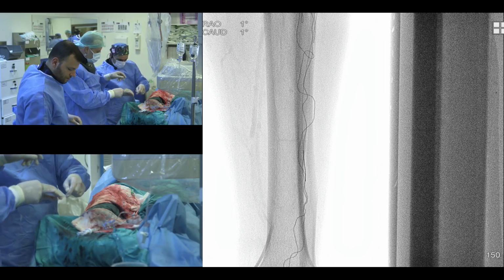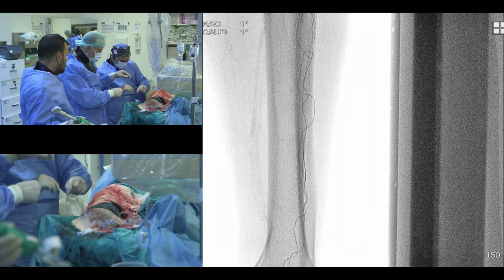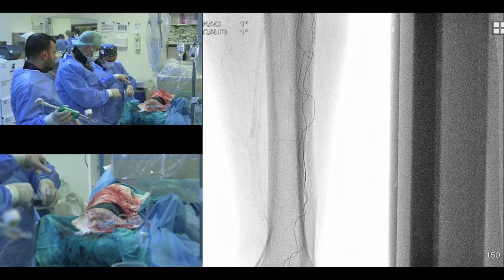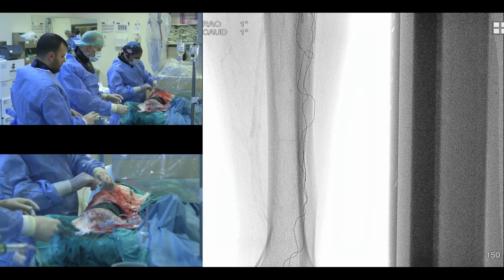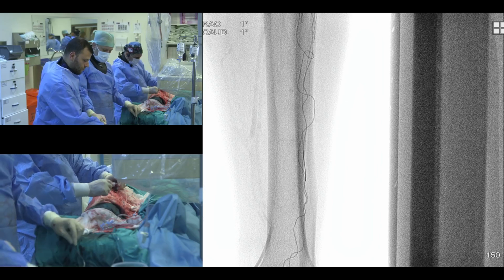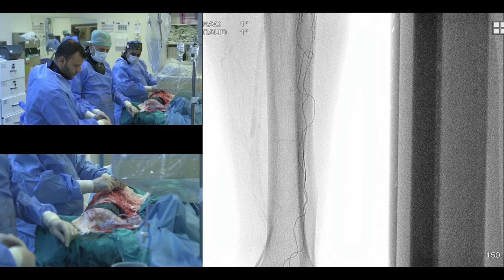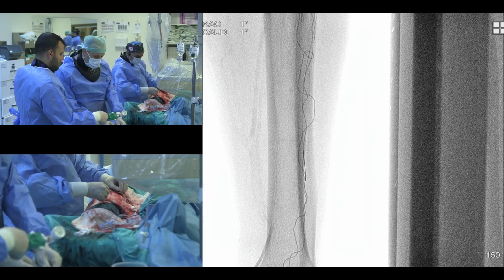You start seeing the posterior tibial artery right where it begins. This is the peroneal artery. This is the posterior tibial artery. The anterior tibial artery is thread-like. I don't see much over here. You see right over here, faint anterior tibial artery. So now I can plan the strategy. If I want to come posterior tibial, I know what I'm doing. If I want to come antegrade or contralateral, I know. So this is why I love MRAs. Also, there's no contrast. So brought him in July 2022, below the knee inguinal ligament.